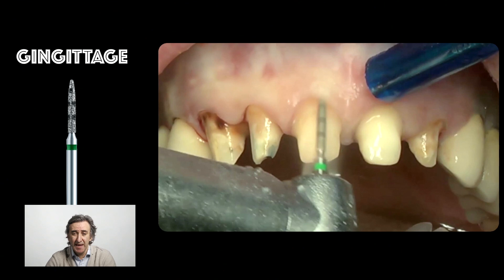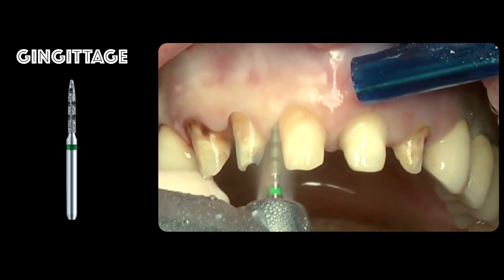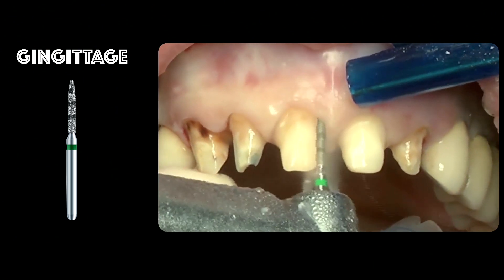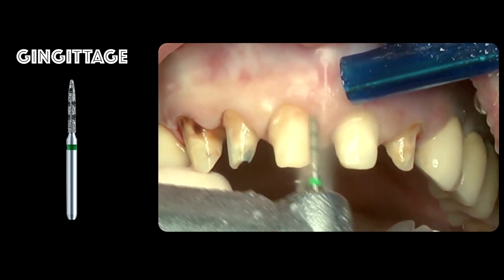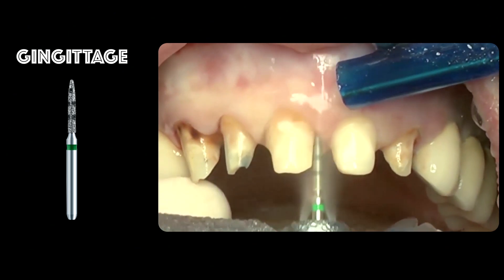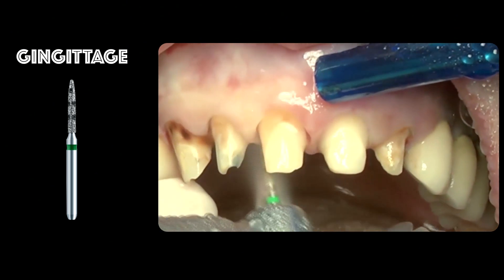So now we go in with a mark bur and we start erasing the chamfer all around, always keeping an eye on the first marking — the first black marking.